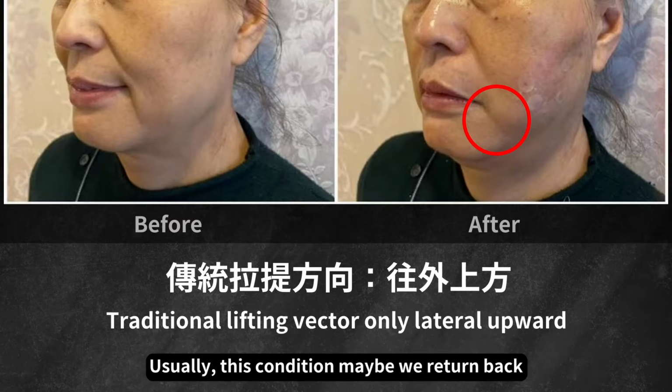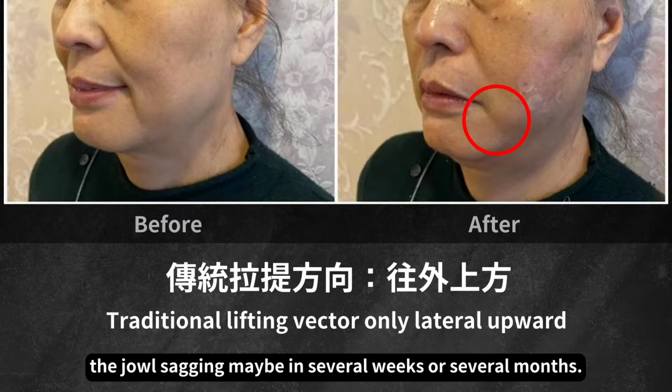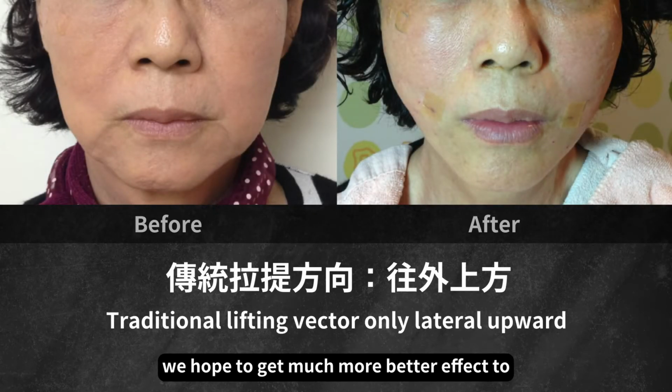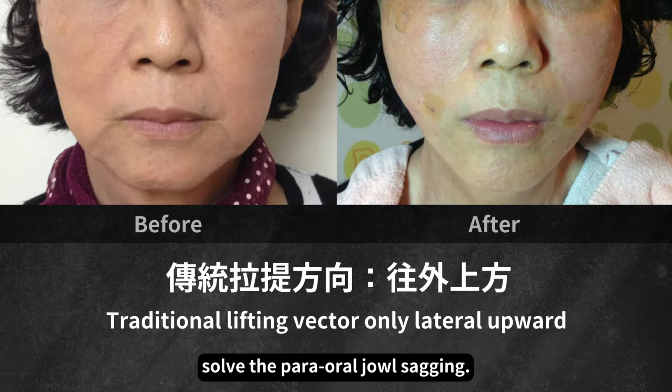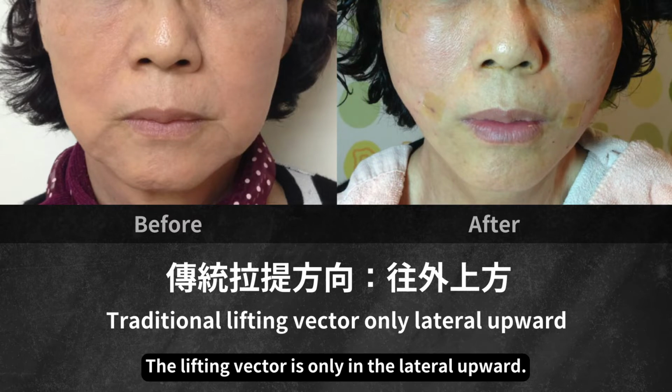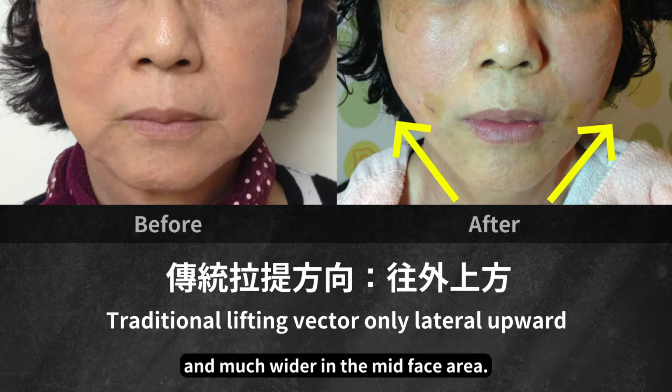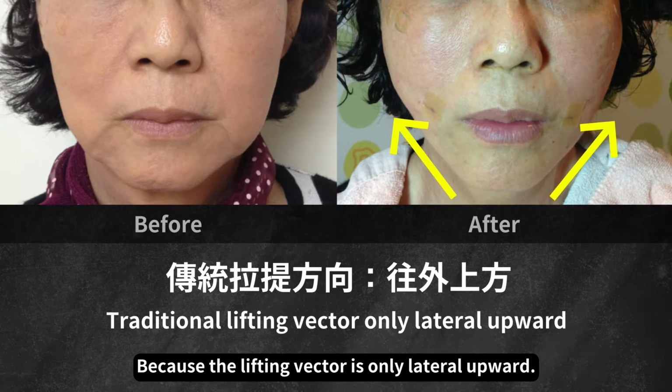Usually in this condition, the jowl sagging may return in several weeks or several months. In this case, we hope to get a much better effect to stop the parallel jowl sagging, so maybe we lift with much more force. The lifting vector is only lateral-upward, because the traditional lifting has this vector. So yes, we get a much better effect, but we get a reverse triangle face and a much wider mid-face area, because the lifting vector is only lateral-upward.